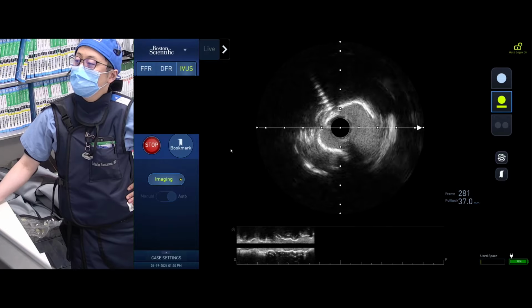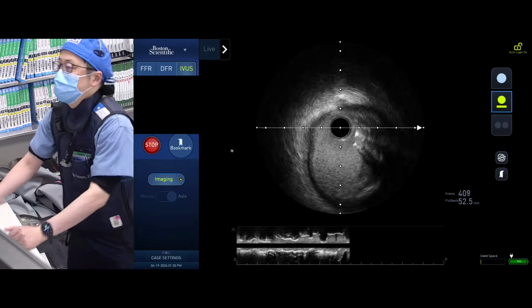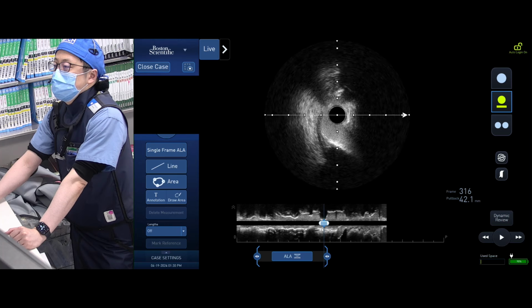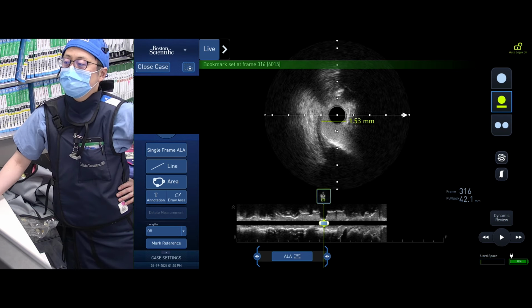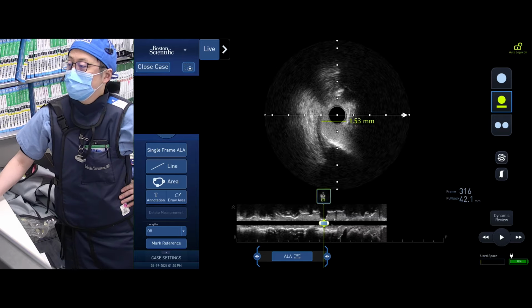How is the nodule doing? Now coming. Yeah, shave the surface. I'll show you. Shaved it? Yep, I will show you. This is our fast IVUS, the Boston Scientific latest IVUS, which looks like an OCT. It can be 0.5, 1, 2, 4, or 8 millimeters per second. So this was the tightest part, the calcium nodule. The MLD was 1.0, now 1.5. The surface is shaved.